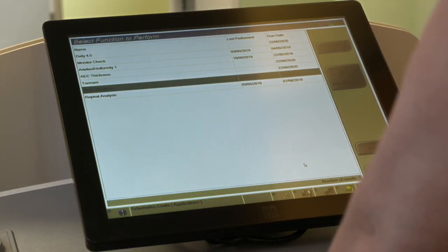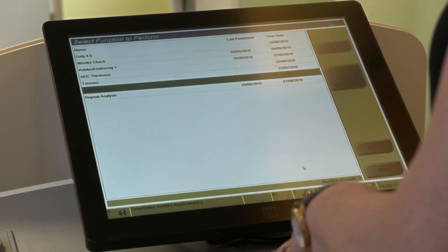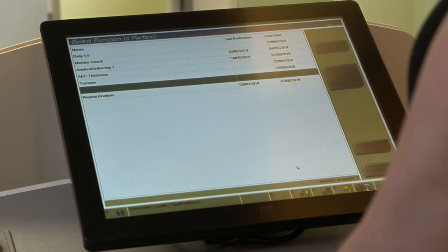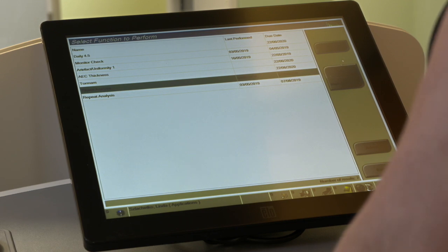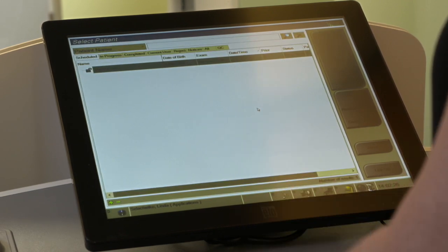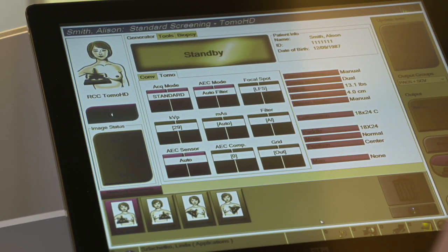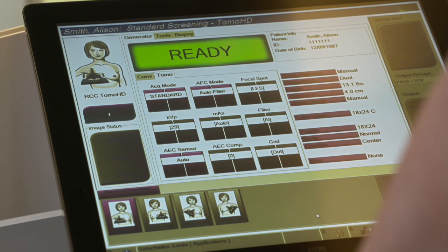The first page that we come to is the QA page, so if there's any QA that needs to be done it's a gentle reminder to do so. We can skip this page and go directly into the work list. We can either click on the patient or we can use the barcode reader which is positioned down here. When we click on the patient it opens up the examination, and at this point we're ready to begin.